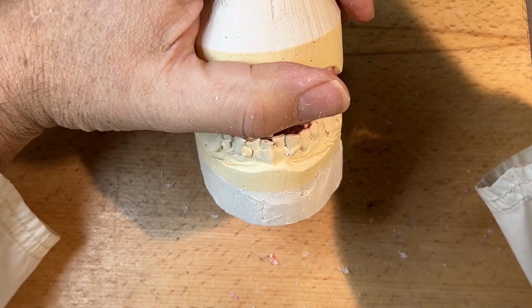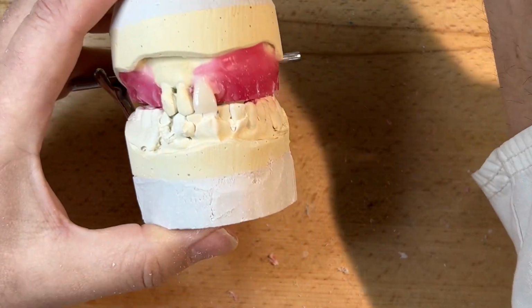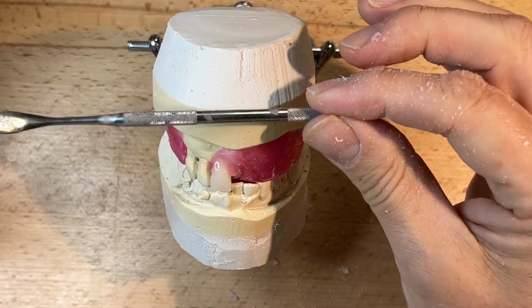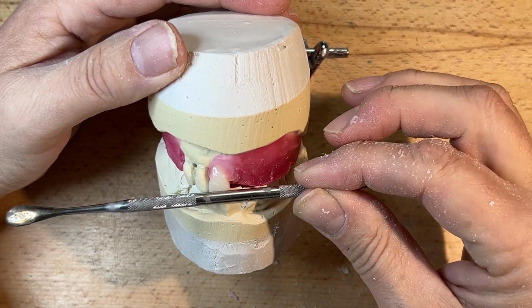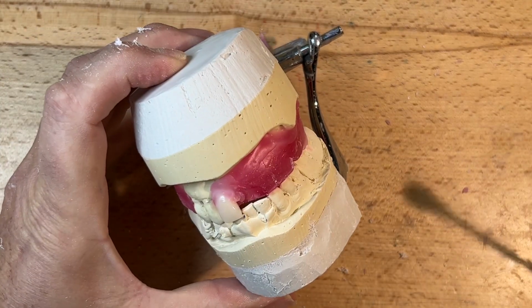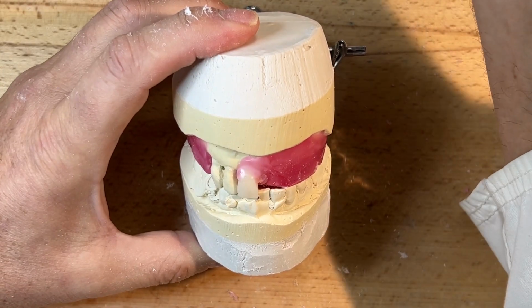It's going to simulate the patient's coverage. Sometimes that helps. I think what's really important is that we've got the base of the model parallel to the plane of occlusion, parallel to the base of the model, parallel to the plane of occlusion. So I don't have my mounting like this, which really throws off my setup. I always have a relationship to the horizontal plane.